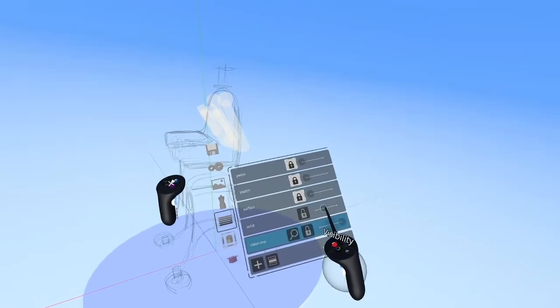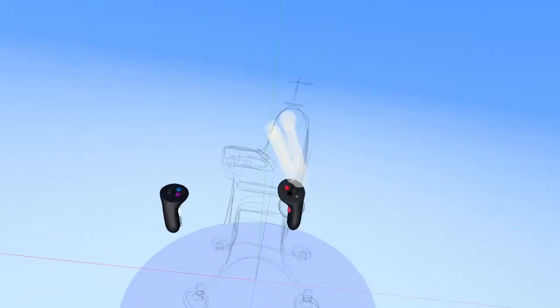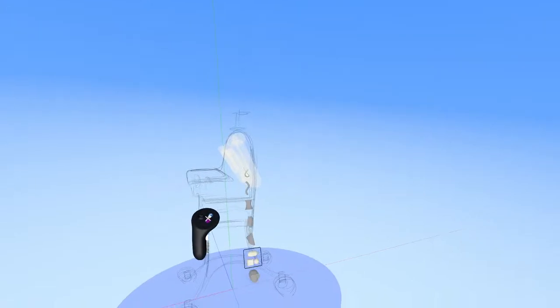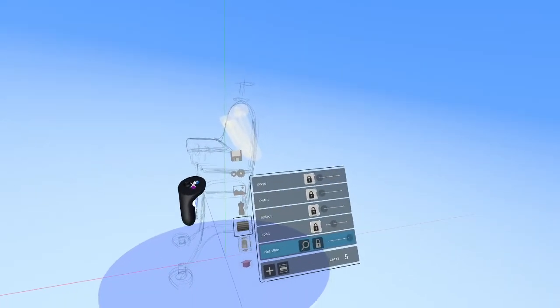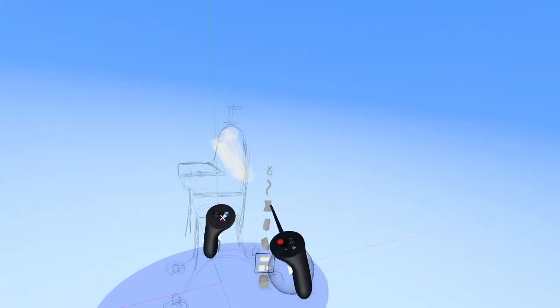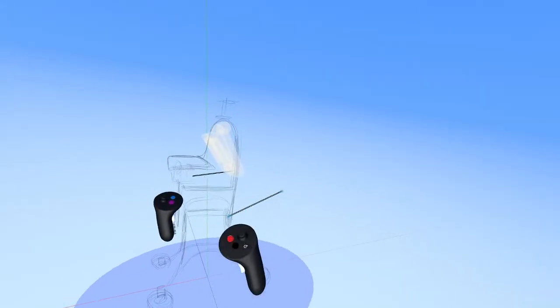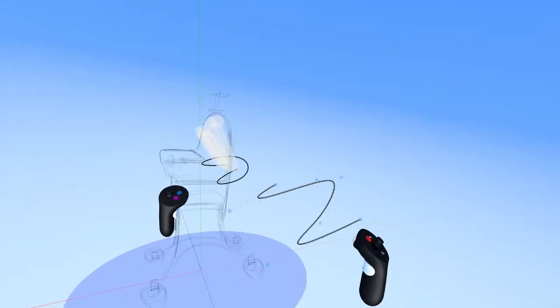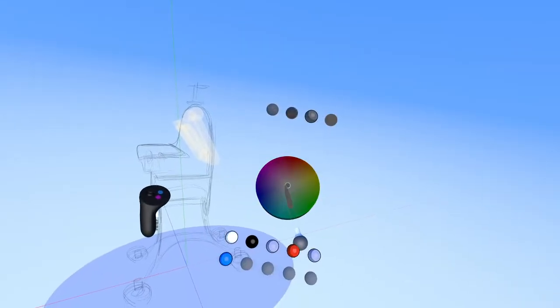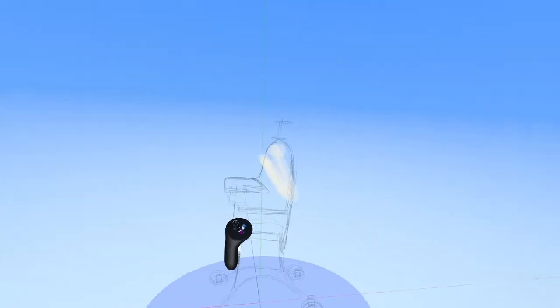So let's turn on the visibility for the robot, or the robit, and lock it. I don't want to be moving these sketch lines around. I just want to use them as reference for right now. All right, the last thing I want to do here is, of course, make sure this layer is active. And then let's go back to the stroke tool here. We have it on point mode. That's good. So now we can click and add a point every time we click. And let's make this a dark black again, or dark blue, something like that.